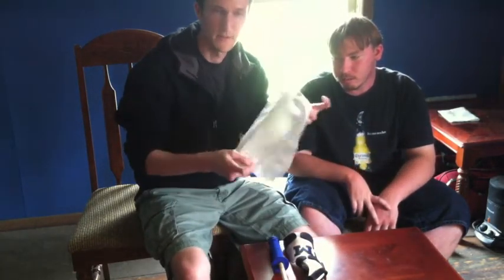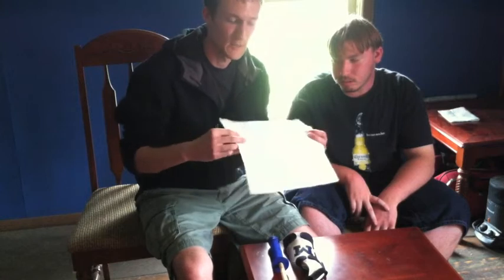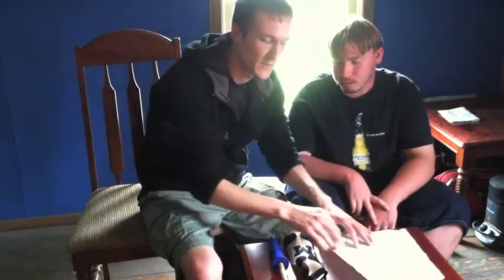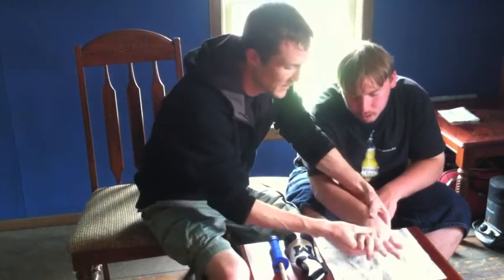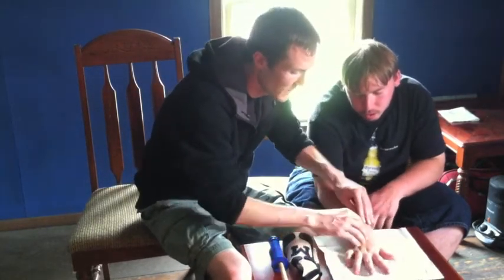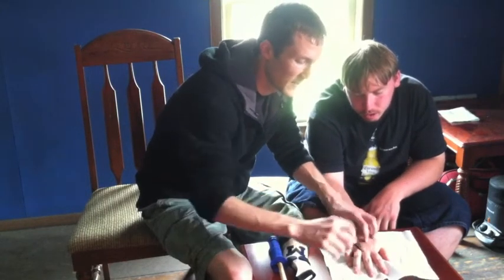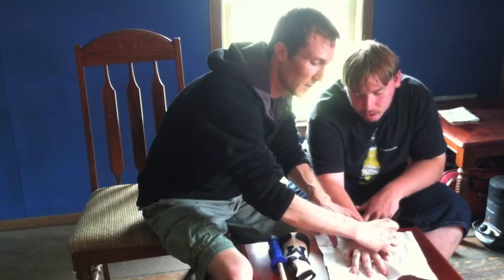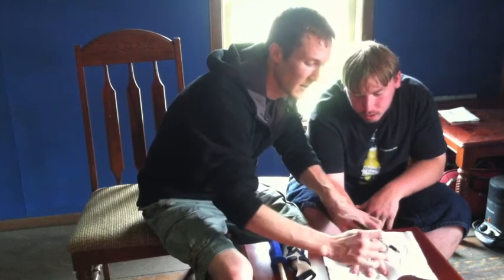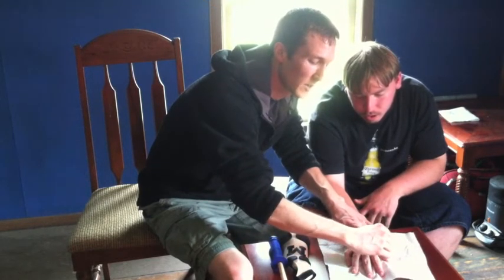So cheap way, if we mess anything up, we can always toss this out and get another sheet. At least we can trace our pattern on this before we actually mold the material. So Nick, go ahead and place his hand down here and try to visualize the wrist out a little bit. I'm going to take a felt marker and first mark the first CMC joint right here in the first phalanx. And then I'm going to go in the first web space right here, and then mark the MP joint here.